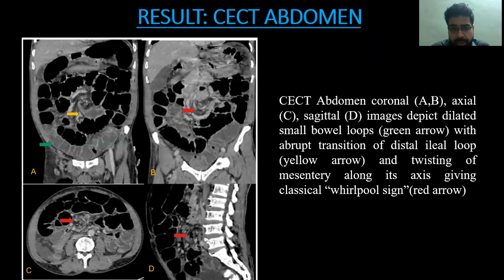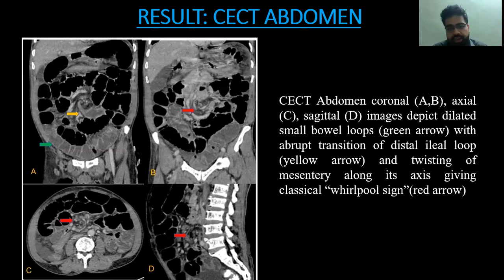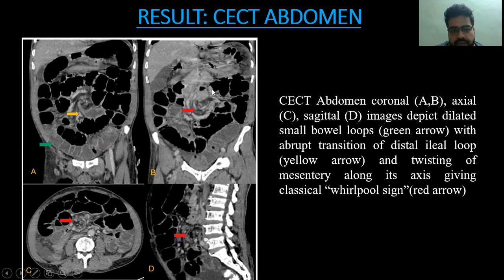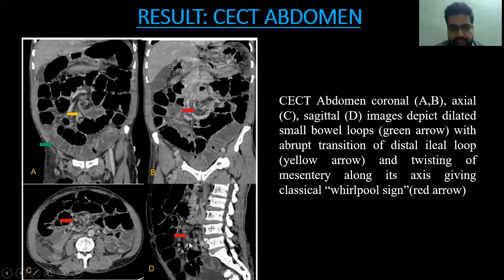The imaging findings on CECT abdomen showed, in the coronal images as you can see, dilated small bowel loops depicted by the green arrow, an abrupt transition of the distal ileal loop, and twisting of the mesentery along its axis, giving the classical whirlpool sign as indicated by the red arrow.